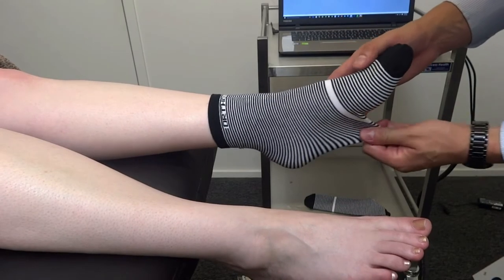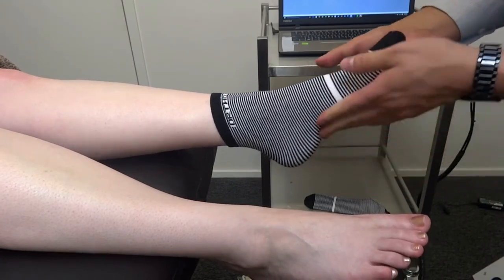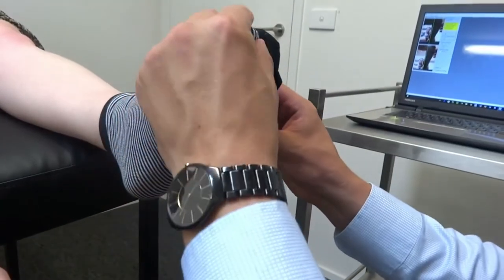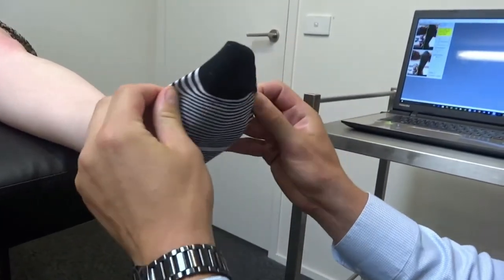Simply pull the sock down off the heel. The elastic in the sock will suck up into the medial, lateral, and transverse arches of the foot. It's also important to make sure the lines are relatively straight.